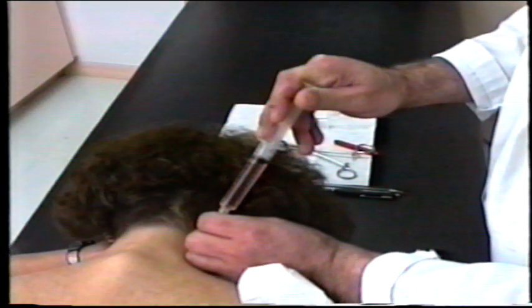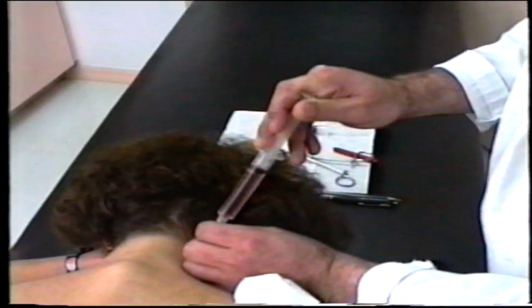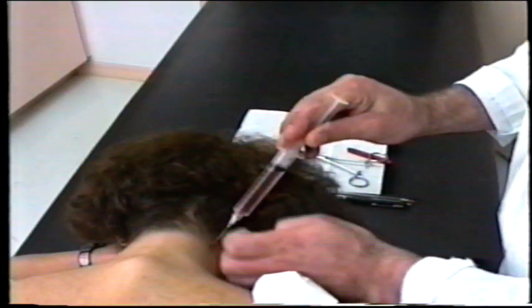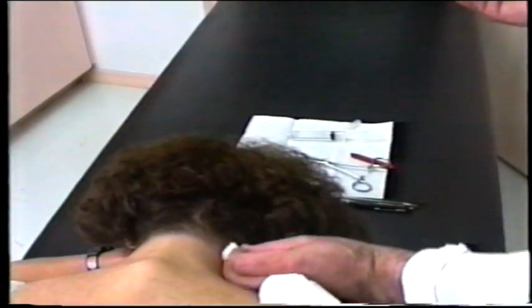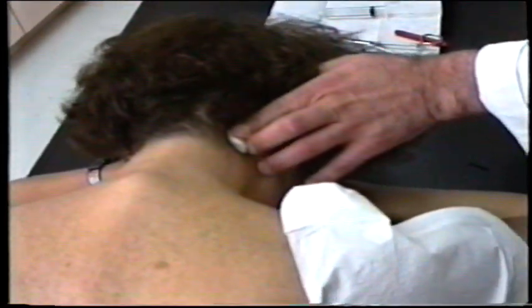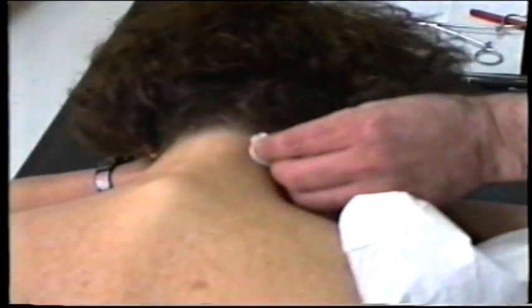I'm trying to withdraw from the syringe so as not to leave the solution in the track of the needle, and fast removing the needle. As you can see, there is almost no bleeding from the injected area. Alright? Now we'll defer our attention to the contralateral side.